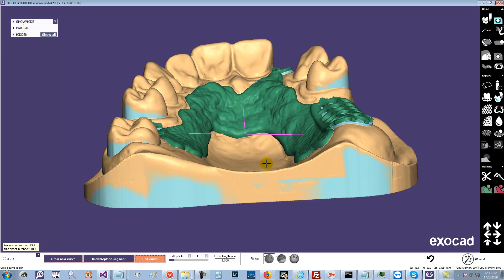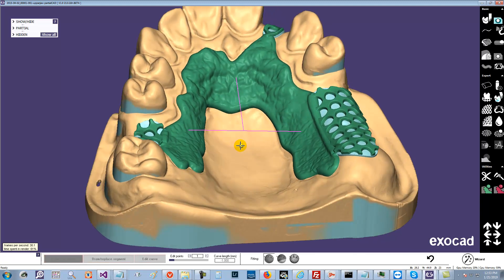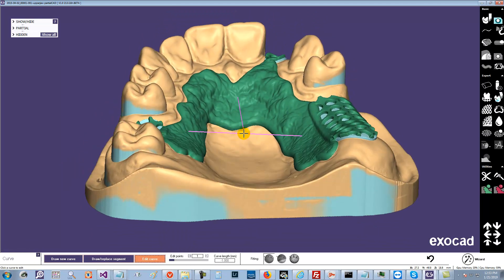Now I'm going to go to Edit Curve. So basically we have, since we double-clicked, it's just a two-point curve — they're straight lines. And now we can add points to these lines. So I'm going to add a point right there.